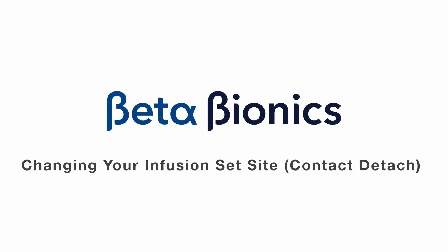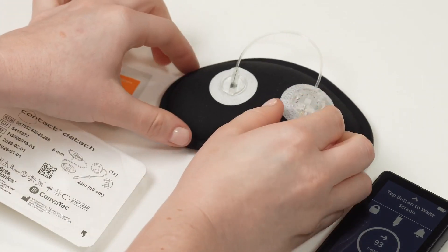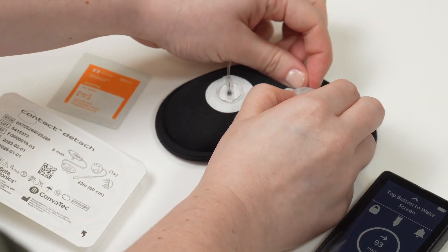Sometimes you may need to change just your infusion set, not your cartridge and tubing. To do this, you need to first gather your supplies. You will need your infusion set and an alcohol swab.